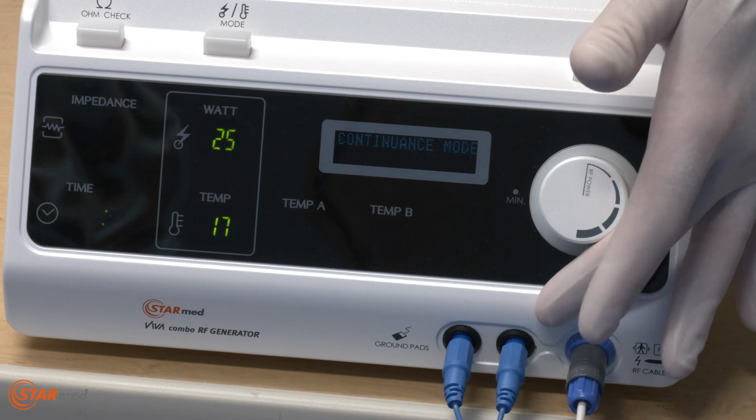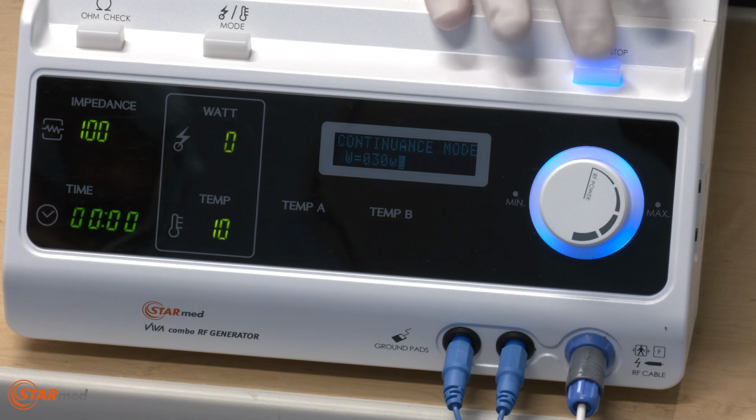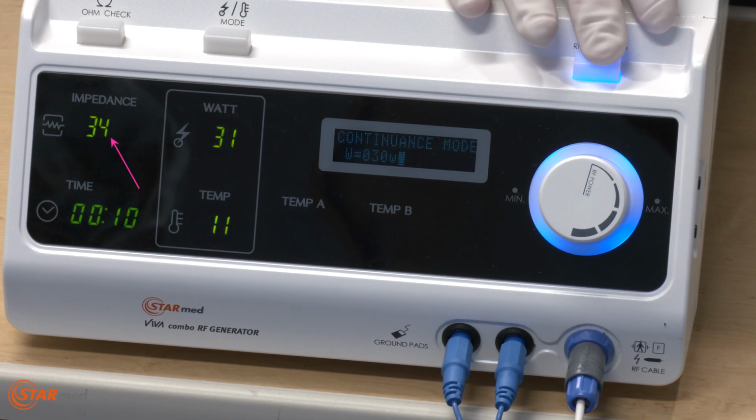Now we're ready to proceed with the ablation, using the generator's start button or foot pedal. This display registers the target watts reading. This display shows the actual watts. Here is our impedance, and here is our ablation time.